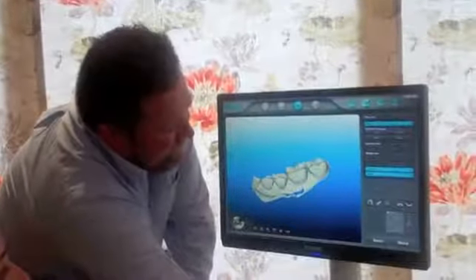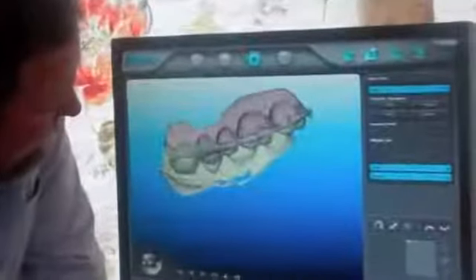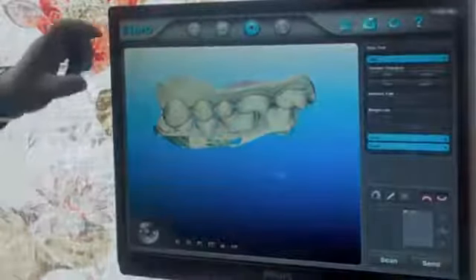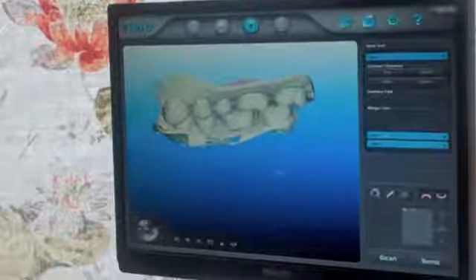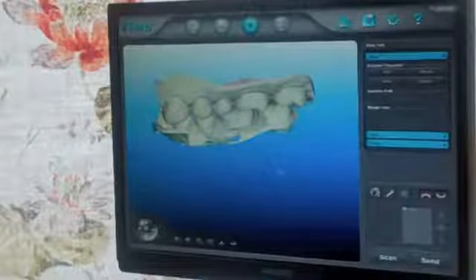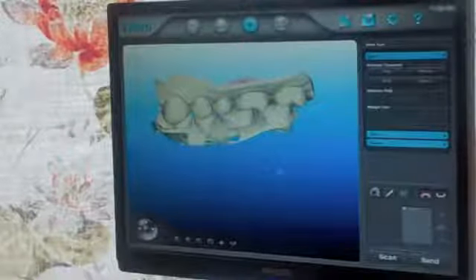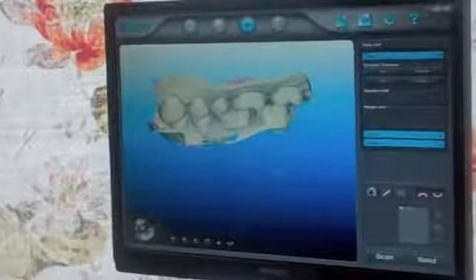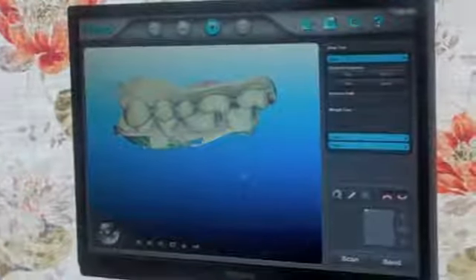If I get rid of this for you now and we bring in the upper teeth, then you can see how the digital bite has approximated the upper and lower teeth together, and this is one of iTero's, or Cadent iTero's things, the perfect bite, B-Y-T-E. So a sort of take on the computer side of things, and we've done hundreds of cases now, and the bite is truly phenomenal.